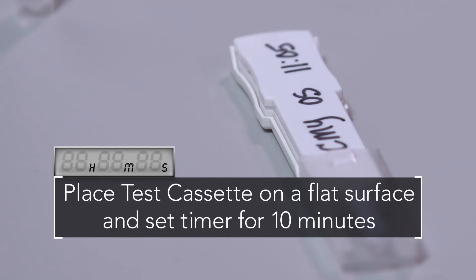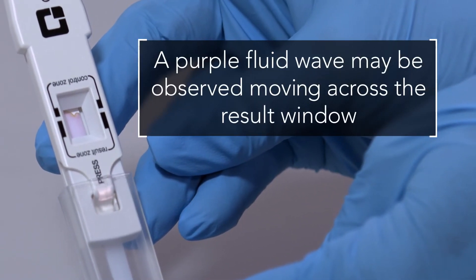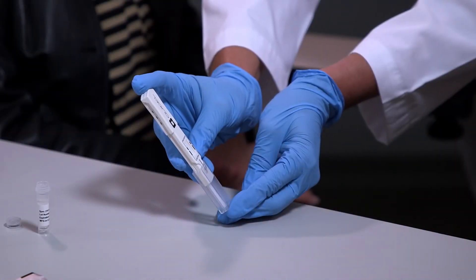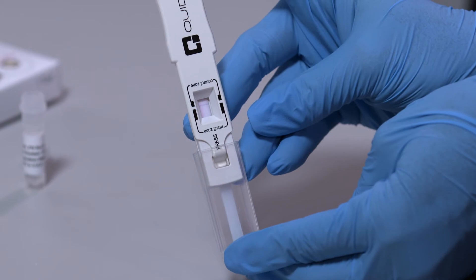Do not interpret the test results before 10 minutes of development time has passed. A purple fluid wave may be observed moving across the result window while the test is running. When the background within the result window is white and 10 minutes have passed, the test may be accurately read.